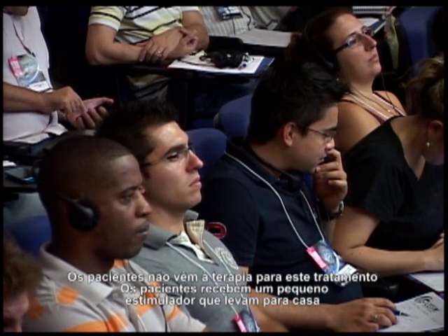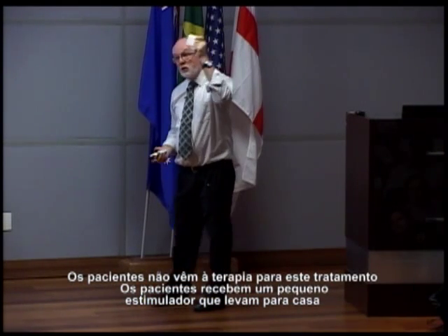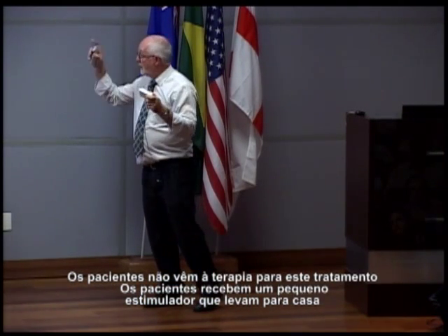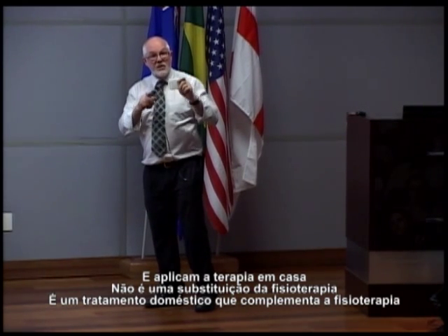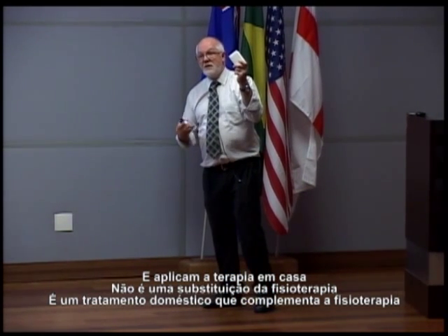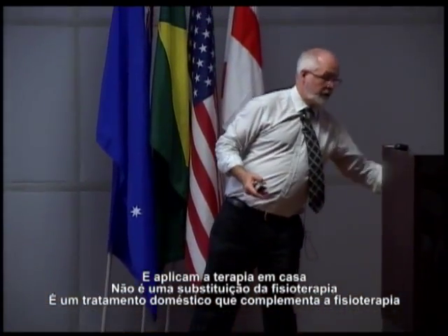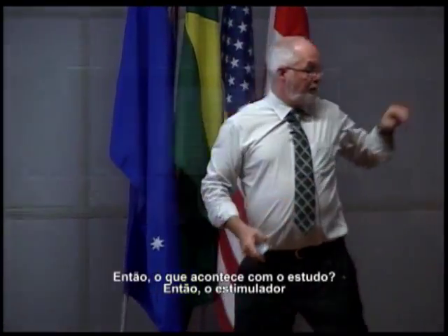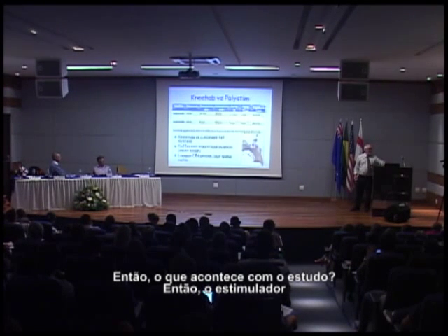The patient has a small stimulator. The patient takes the small stimulator home, and they do this as home therapy. It's not instead of physical therapy. It's a home treatment in addition to physical therapy, physiotherapy. Okay, so what happened? What happened in the study?